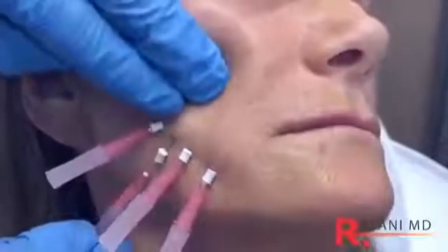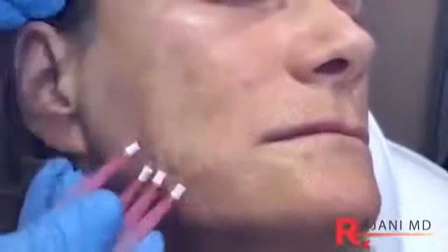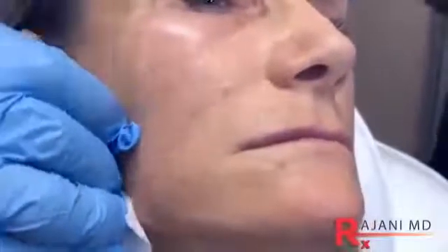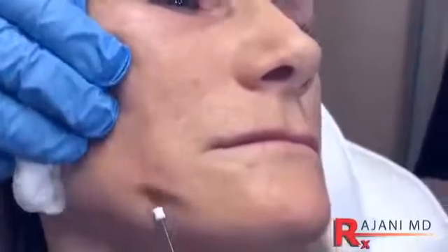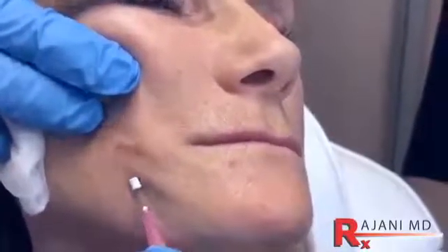Now the twists add a little bit more volume, but one of the reasons I'm using them here is because really what I want from them is, yes, a little bit of that volume, but I also want more thread, because more thread means more collagen building. So we're getting two benefits.